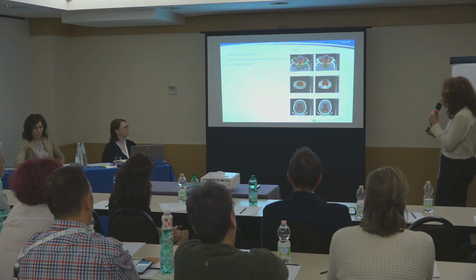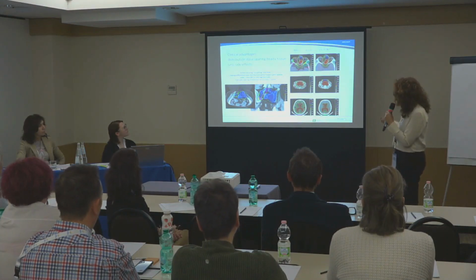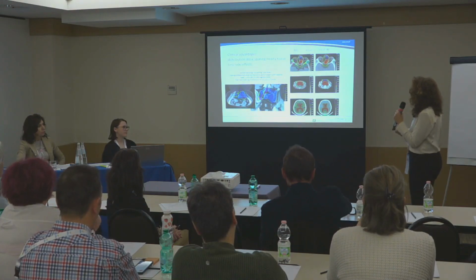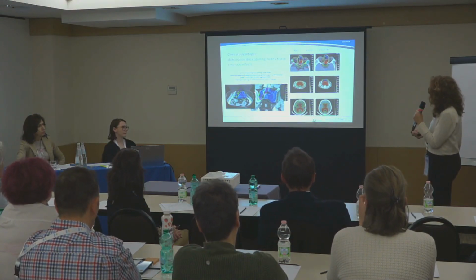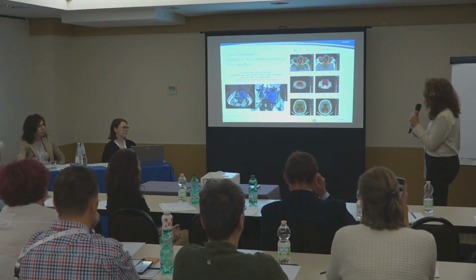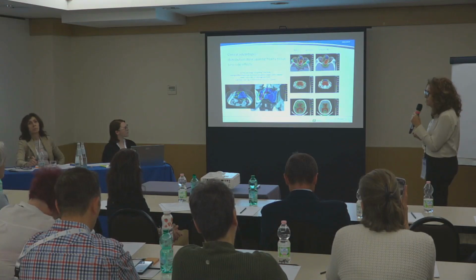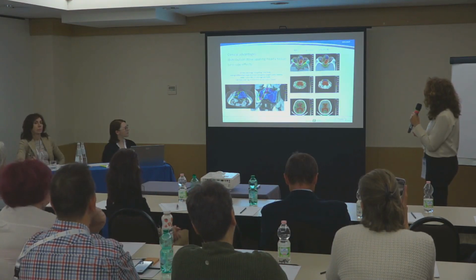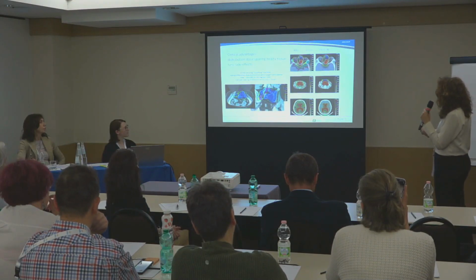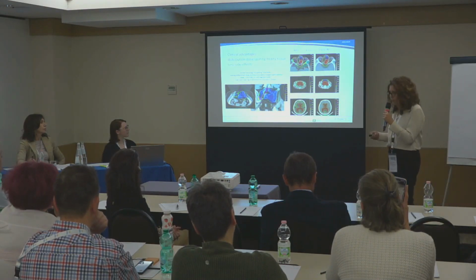brain tissue. The technology is helping us to improve these advantages, and you can see this technology is active scanning: we have a beam with active scanning, giving us the possibility to create different dose distributions within the same target volume. You can see here the example of sparing selective nerve roots in the same tumor volume.